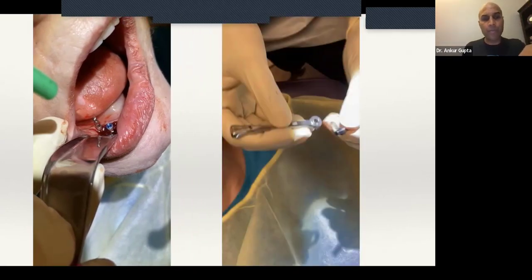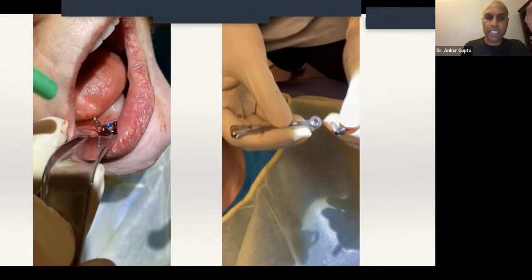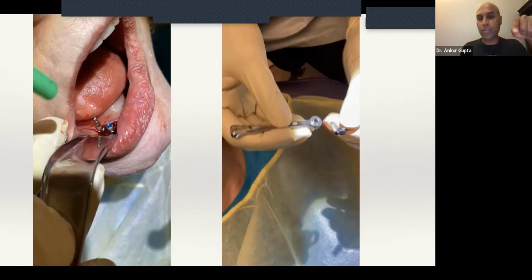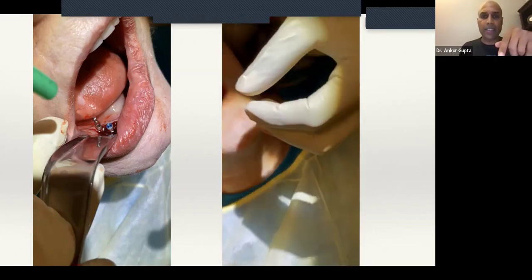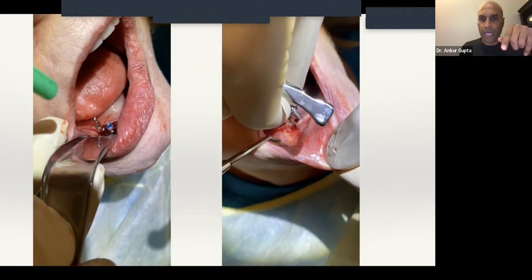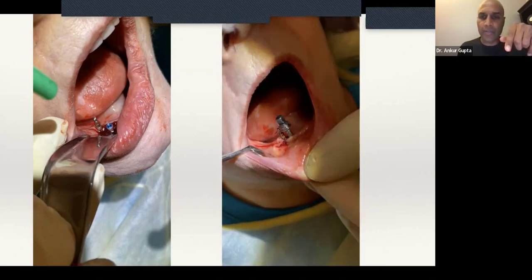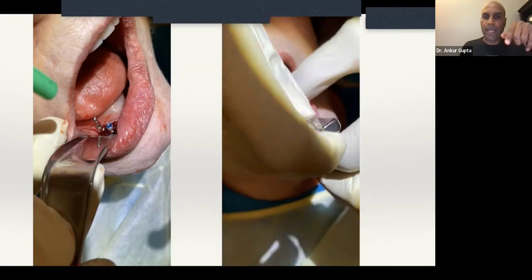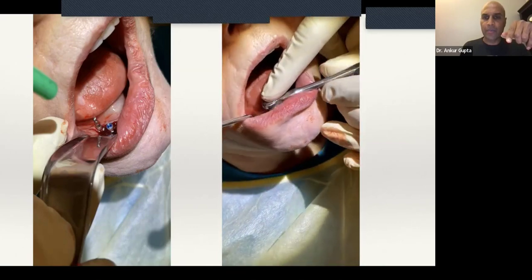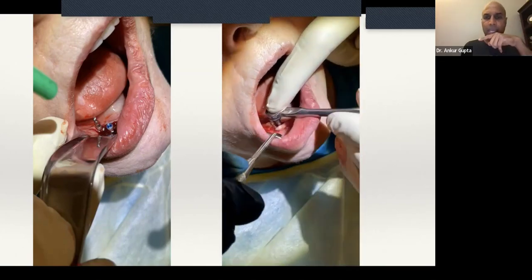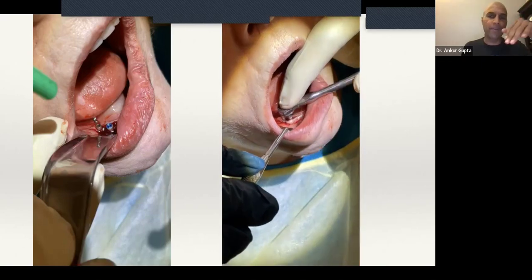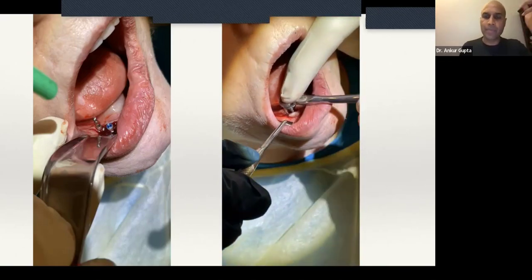My handpiece didn't have enough strength to deliver the implant completely to the level of bone. So for the rest of the placement, I'm using an actual ratchet — a torque wrench. I lodge a torque driver into the internal hex of my implant, and then use a torque wrench or ratchet to extend the rest of that implant all the way to the desired depth, which is usually about the level of the bone or just a tiny bit below. Then I'm done with the surgery.